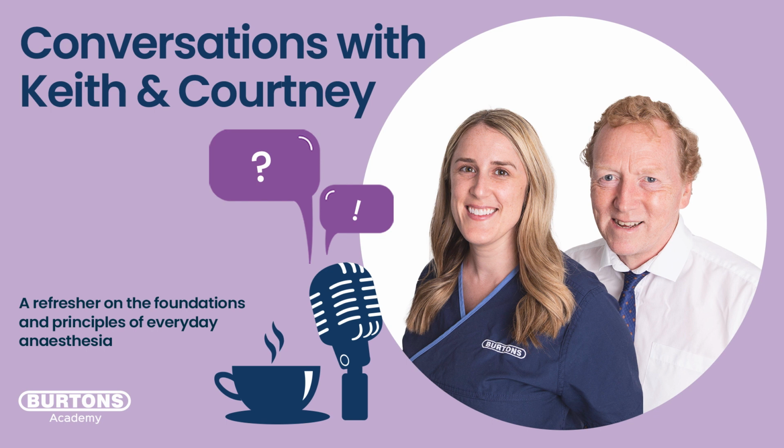So thankfully, two things in my experience. Sometimes they just don't breathe, and that's why I'm like, right, straight onto the ventilator. And then I found it quite easy to actually exploit their normal drive to breathe. So it's not as scary, I think, as people.